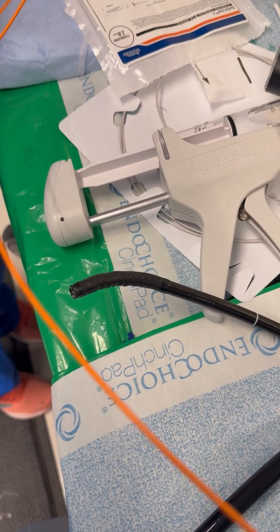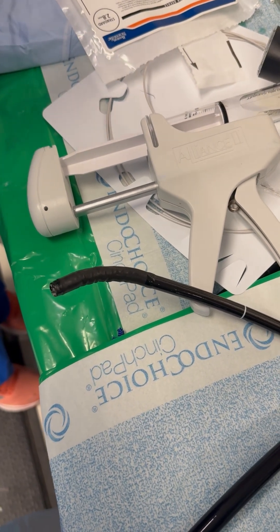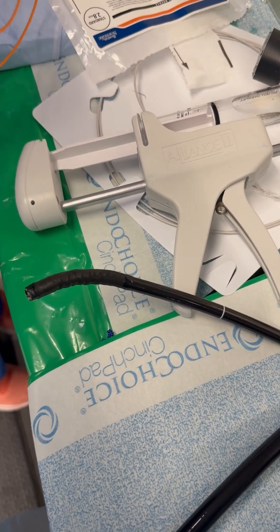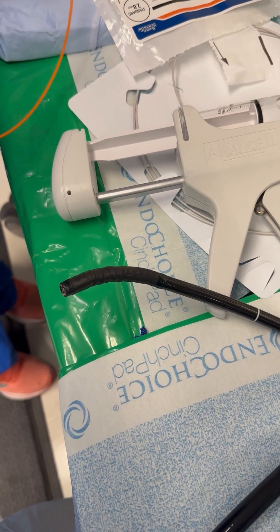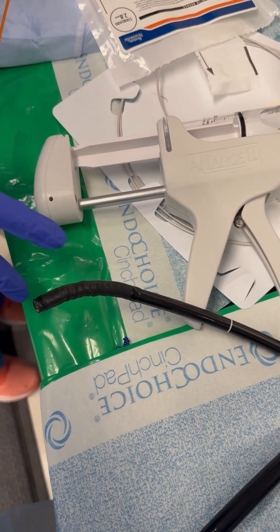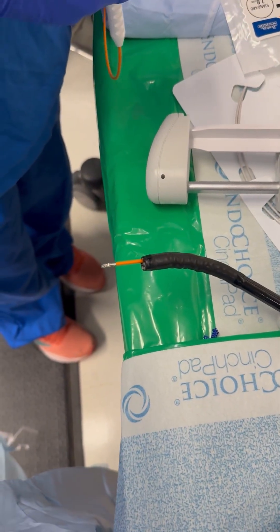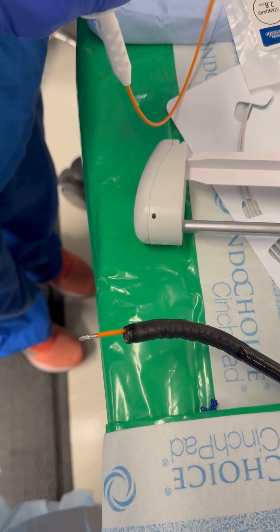Can we fire it down here? Yeah. Coming out, coming out — got to be patient. That's why your doctor needs to be patient. There you go. Open it. There you go. Small tiny bites.